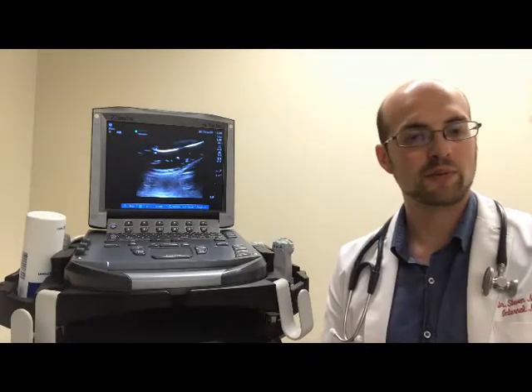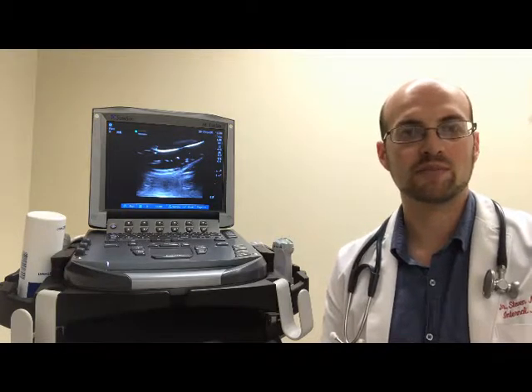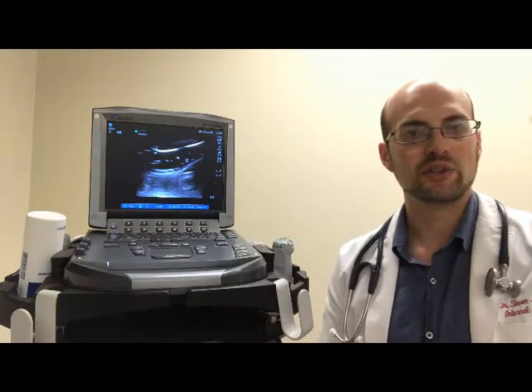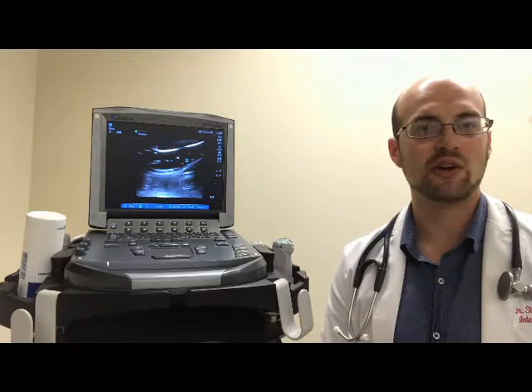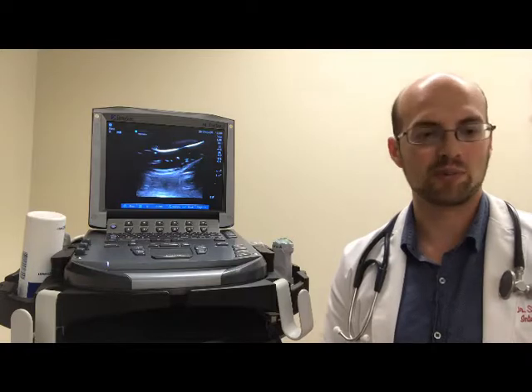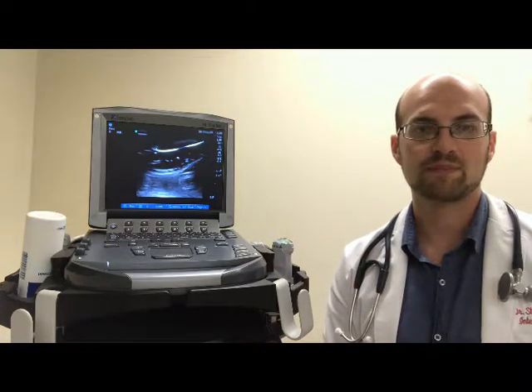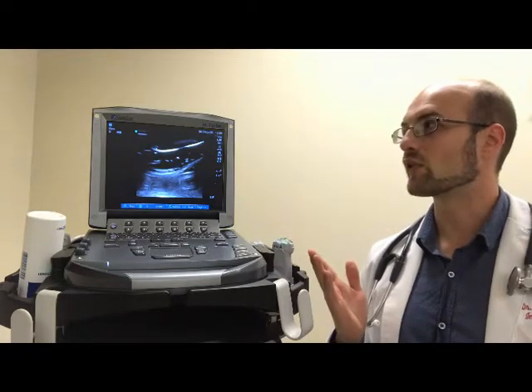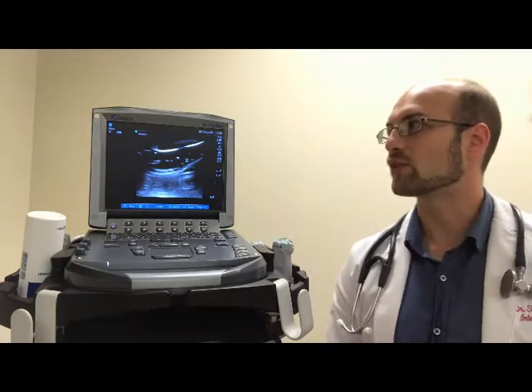This is Steven Montague from Queen's University General Internal Medicine. In this short video I'm going to show you how to save images and videos on the Sonocyte mTurbo and how to export them from this device. This is the Sonocyte mTurbo, which is one of the ultrasound machines that we use here at Kingston General Hospital.